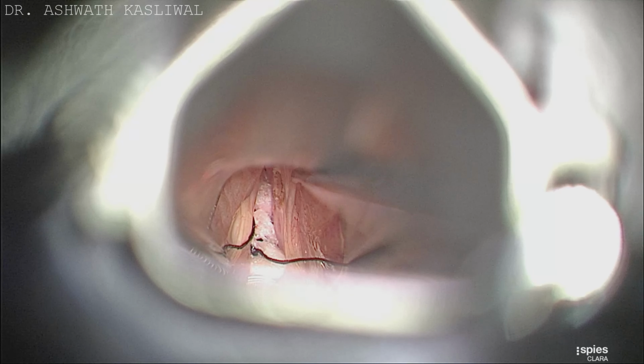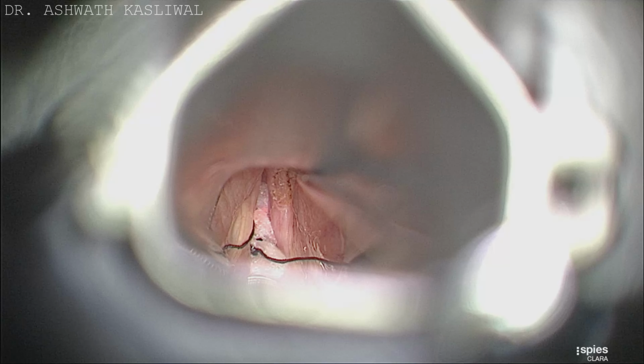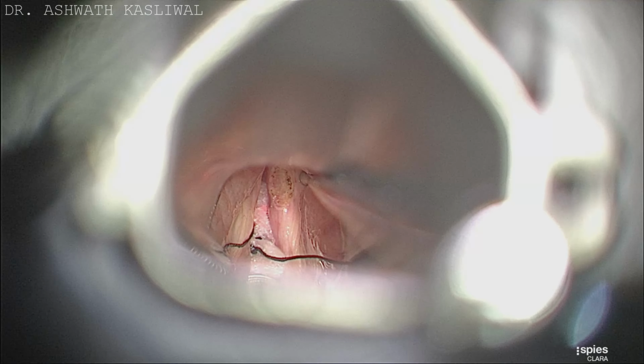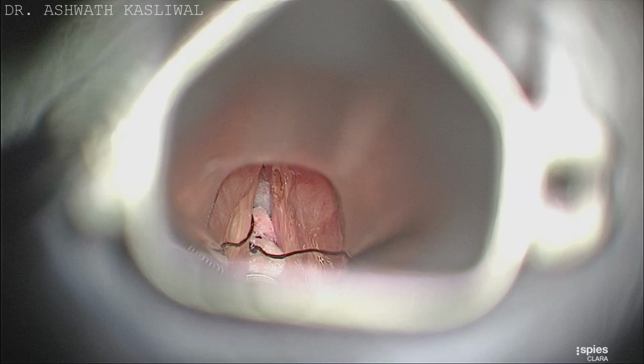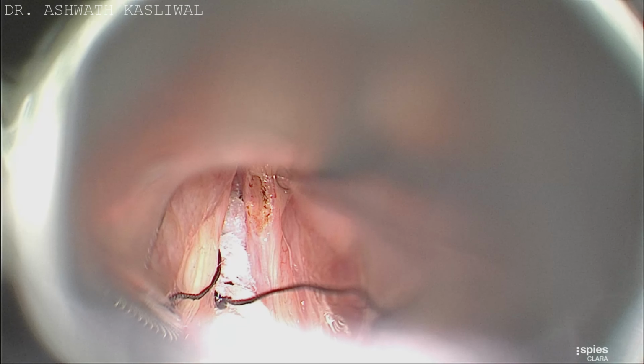After complete removal of the lesion, it is important to visualize the vocal cords with a probe in order to confirm complete removal of the polyp.